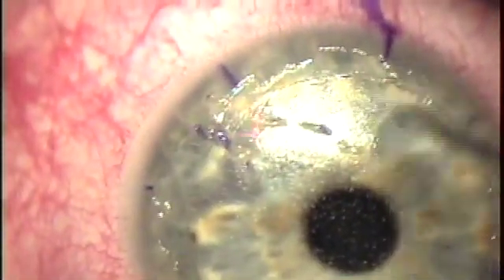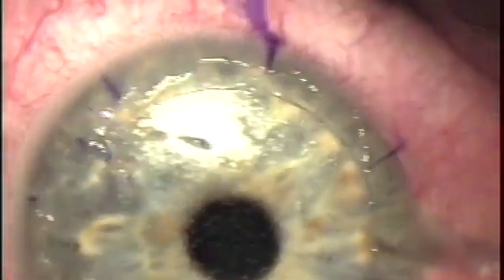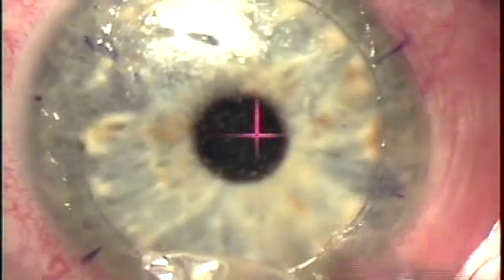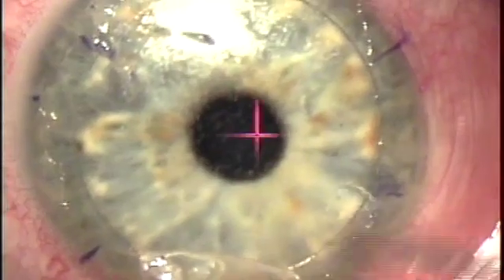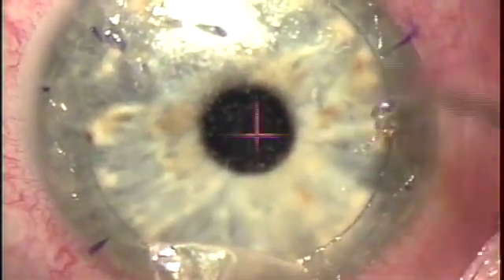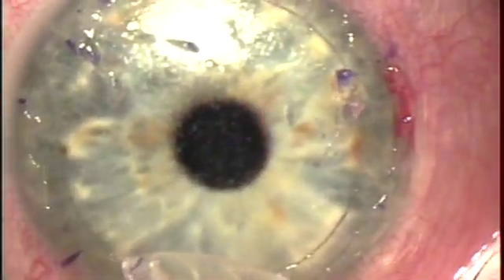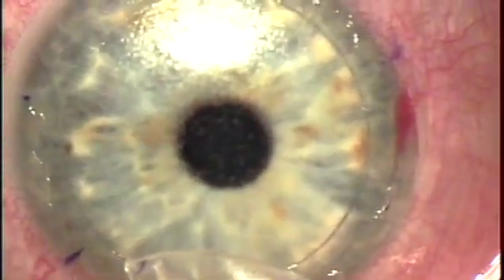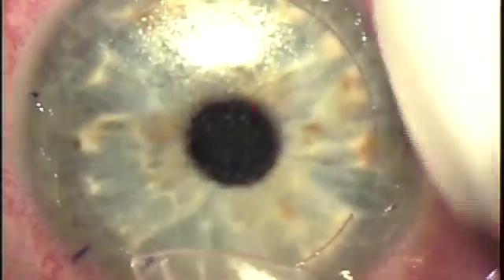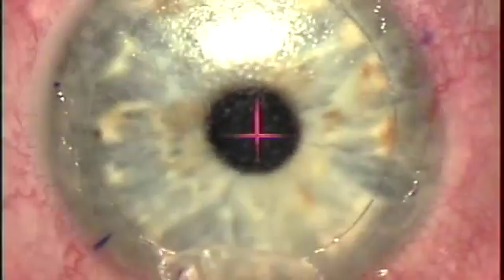And so in this technique, what you see the surgeon doing is removing the epithelial cells on the rim of the cornea outside of the flap edge. Perhaps 1 or more than 1 millimeter of cells is removed using a blunt corneal spatula. We carry this debridement from edge to edge around the rim of the flap, and then clean up the surface using a wet sponge and moisten the cornea. It takes perhaps 30 or 40 seconds to complete this part of the treatment.